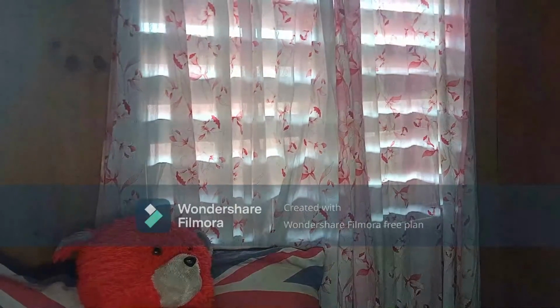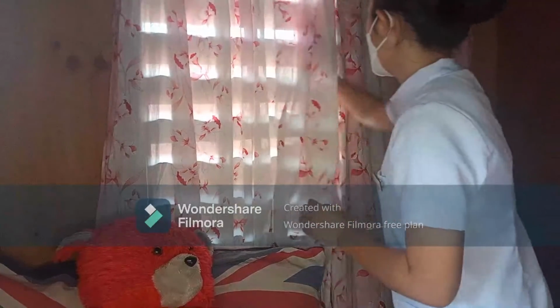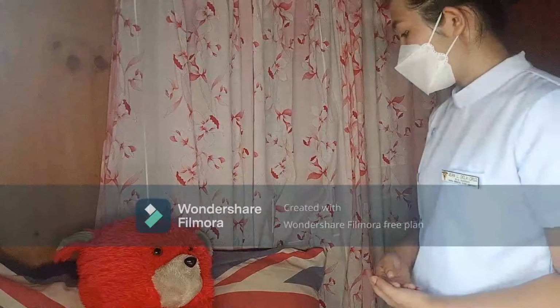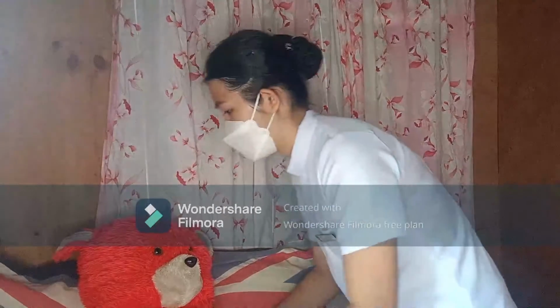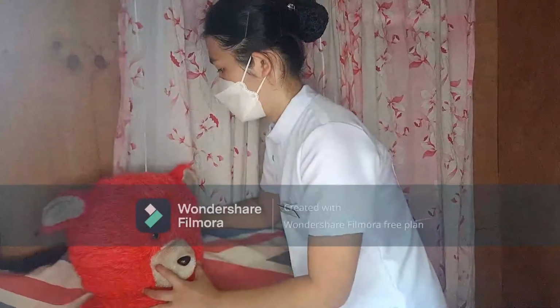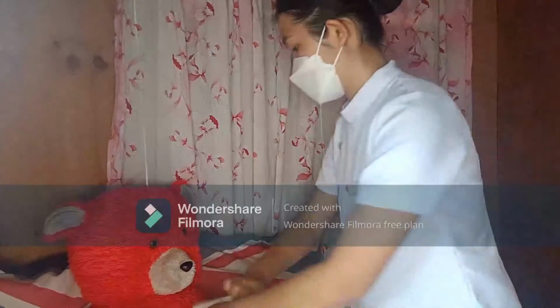Then, provide well-lighted room. Next to that, provide privacy by screening and closing windows and doors. Assist the client to a high Fowler's position if his or her health condition permits, and support the head on a pillow. So, before that, ma'am, I will adjust first your bed. Place a towel or disposable pad across the chest.